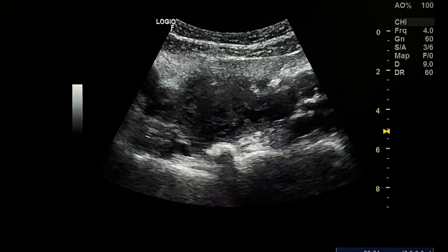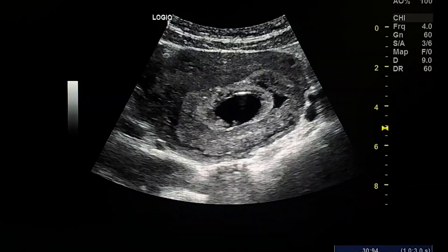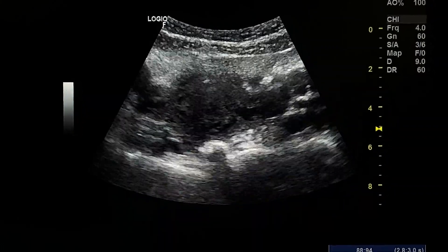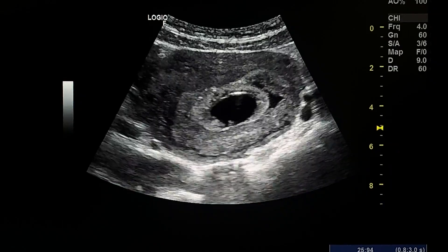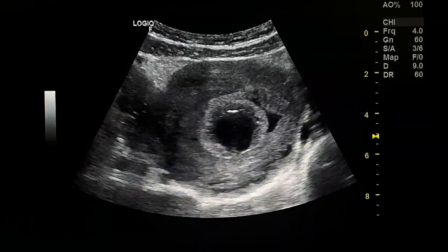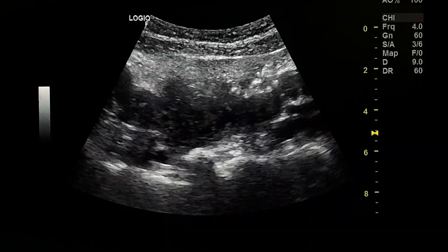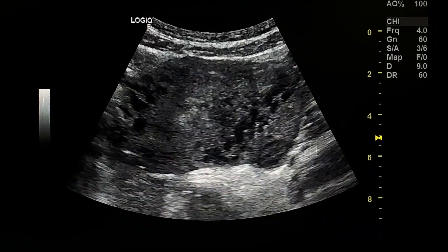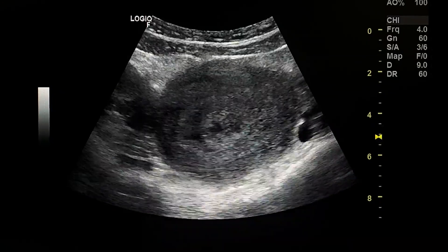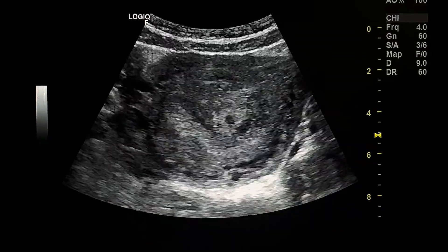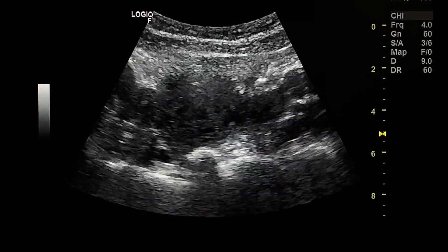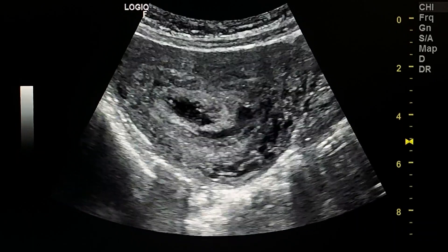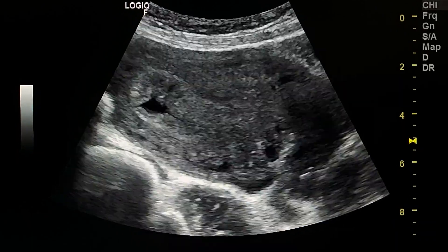This is a case of early pregnancy failure. We see a gestational sac with hydropic changes in the wall, yolk sac, and fetal pole.